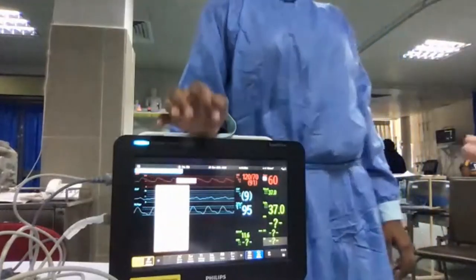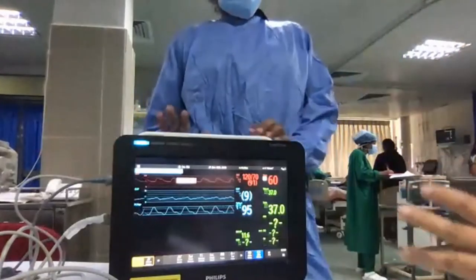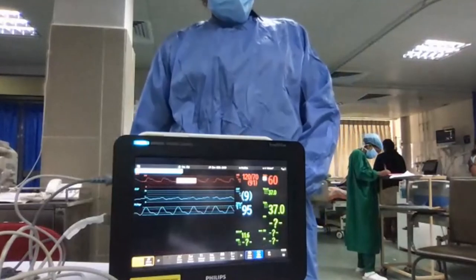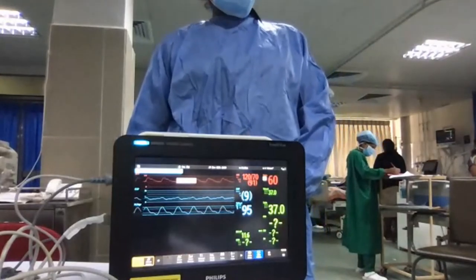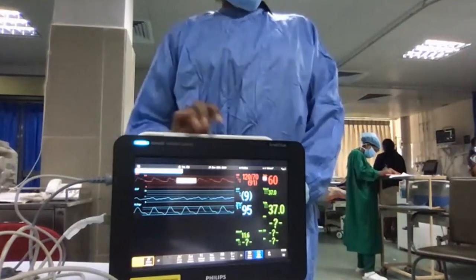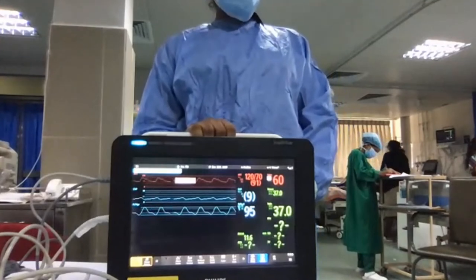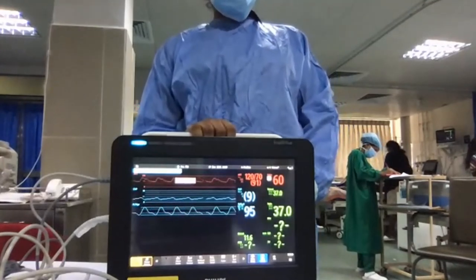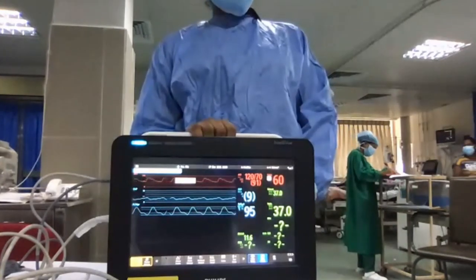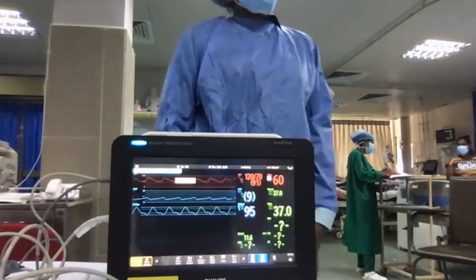So now the issue is, this is a conventional monitor which has ECG already designated. This is a sort of conventional Philips monitor which has got a PiCCO module. So when you try to set up the PiCCO, it's a struggle, because you don't have much time to struggle and set up the PiCCO. So they are going to set up a proper screen. It will be only a PiCCO dedicated screen. So it won't be a monitor that gives ECG and so on.